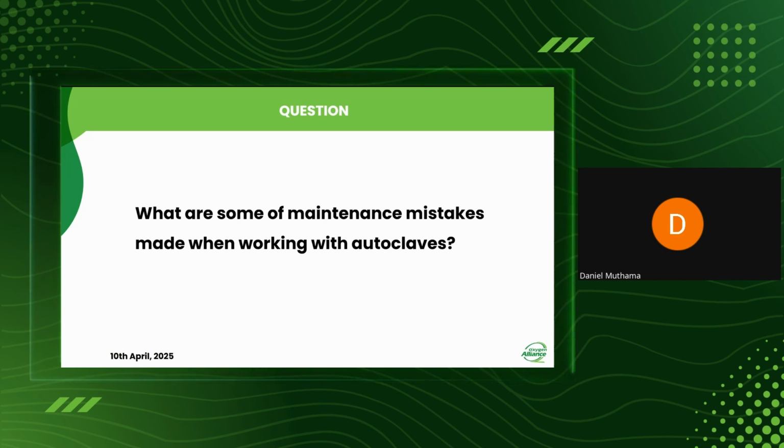And sometimes what we call the quick guide is placed just beside the face of the equipment for the technical person to be able to follow. That is, let's say you have repaired the equipment and you would want to run that equipment.